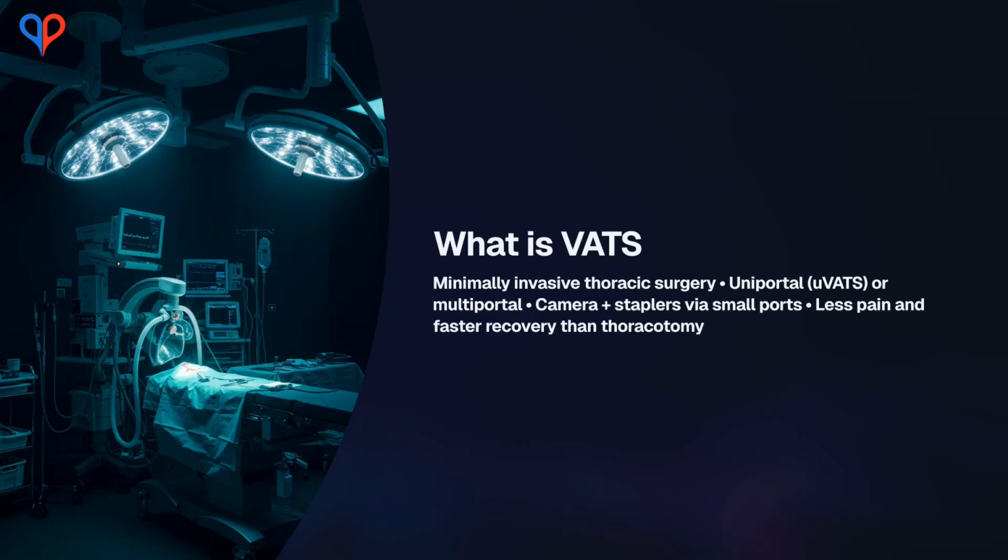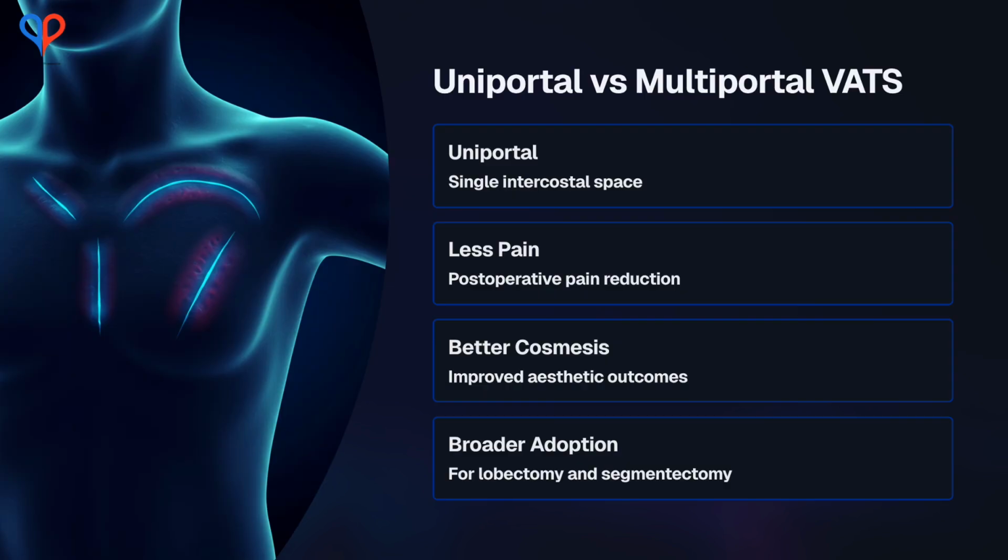VATS is a minimally invasive thoracic surgery technique using a camera and small instruments inserted through the chest wall. Many centers now use uniportal VATS, which accesses the chest through a single intercostal space. Uniportal VATS reduces pain, improves cosmesis, preserves chest wall mechanics, and allows advanced resections like lobectomy and segmentectomy.